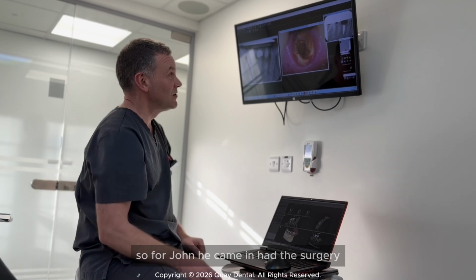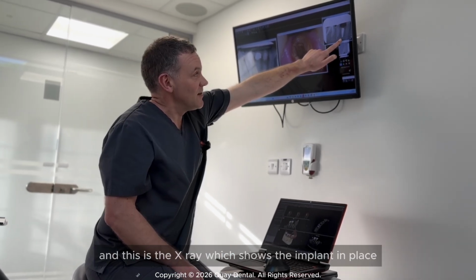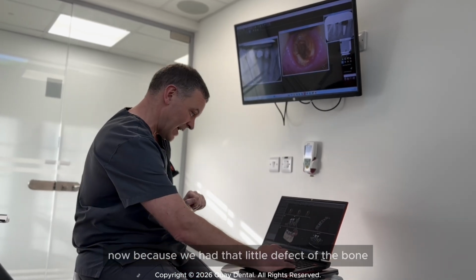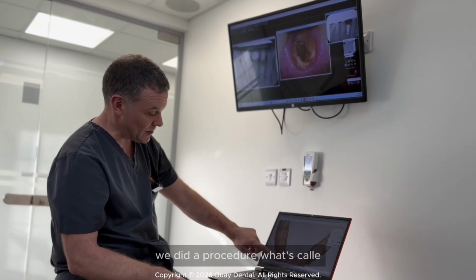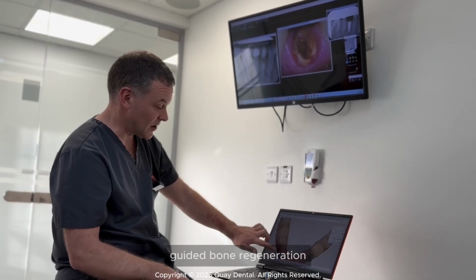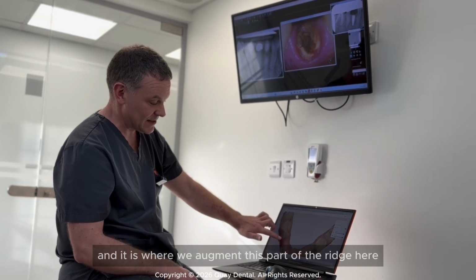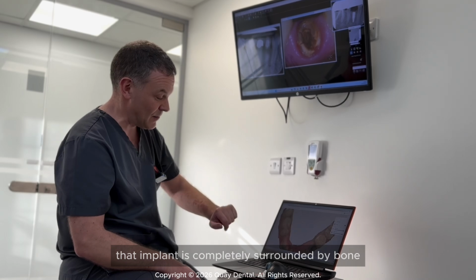So for John, we came in, had the surgery, and this is the x-ray which shows the implant in place exactly where we placed it. Now, because we had that little defect of the bone around here, at the time of placement we did a procedure called guided bone regeneration, where we augment this part of the ridge here to make sure that that implant is completely surrounded by bone.